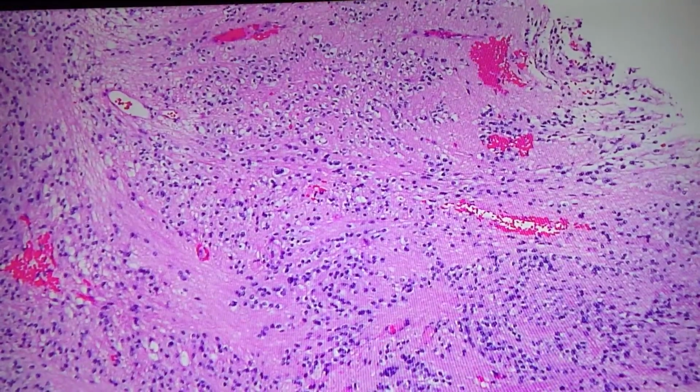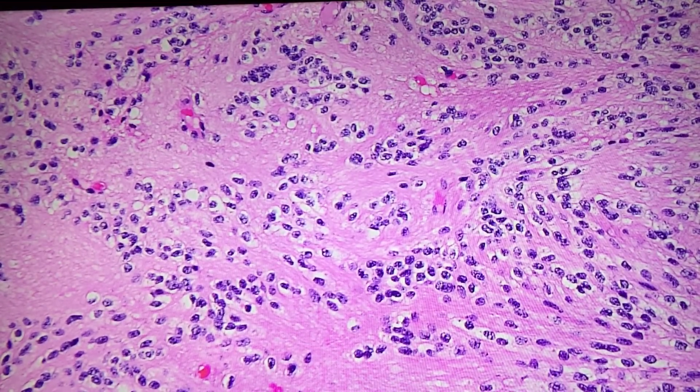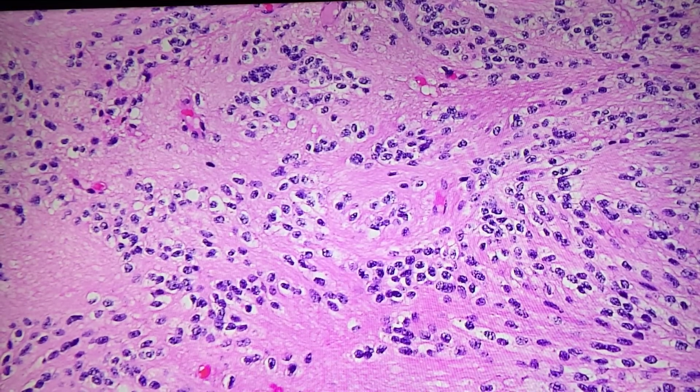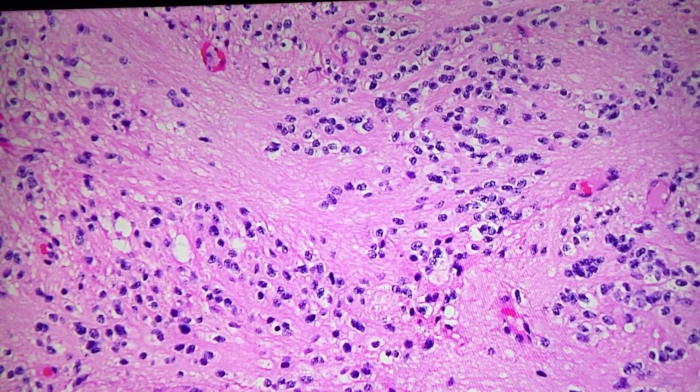We go back to the map. Actually, haven't we seen this case? Oh, okay. All right. So see those zones of glial tissue without nuclei? See, there's a small vessel up at the top with an anucleate glial zone around it. You see that? And then there are these cells around it. So what is this? Close. It's an ependymoma, yeah. So this is also in the spinal cord, up further than the previous case.